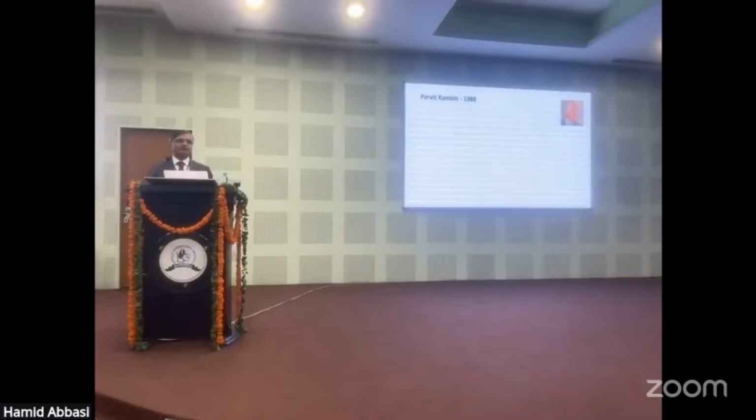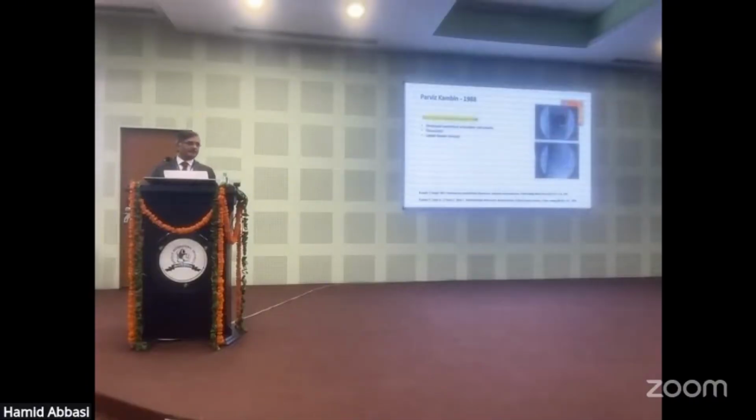Then came the era of Kambin. I think he extensively studied all these things, and then he popularized how everything needs to be done. And that is in 1988. The first thing that he did was not fusion. The first thing everyone knows that he did was an arthroscopic microdiscectomy. And he defined all the things which were not matching the previous nucleoscopes. He built the articulated instruments and specialized instruments which are required, and did the discectomy and lateral approach also.